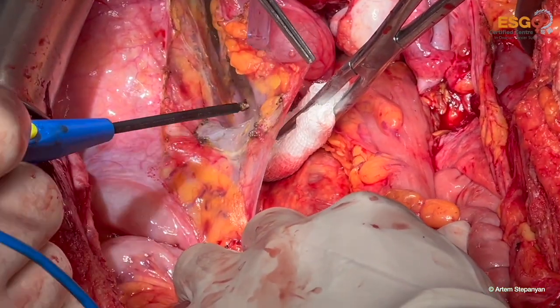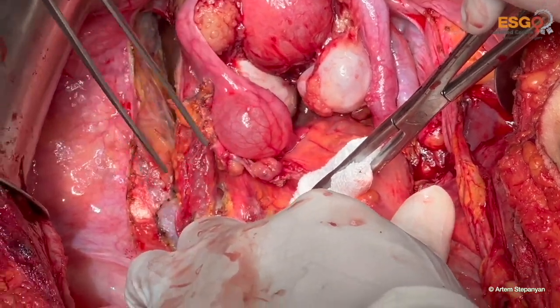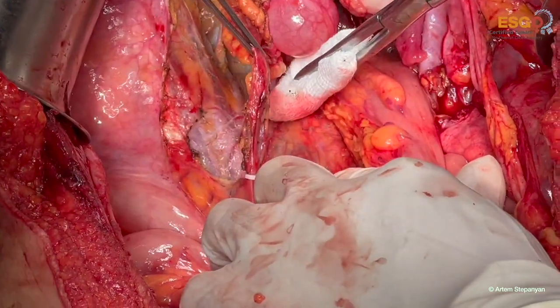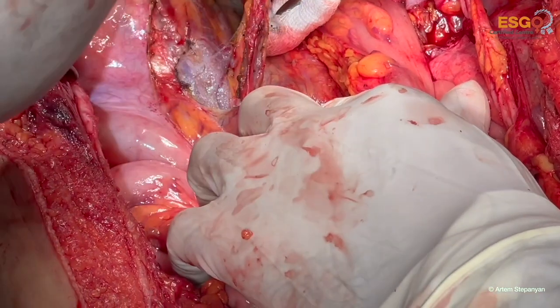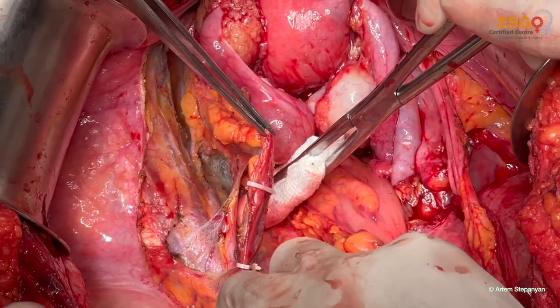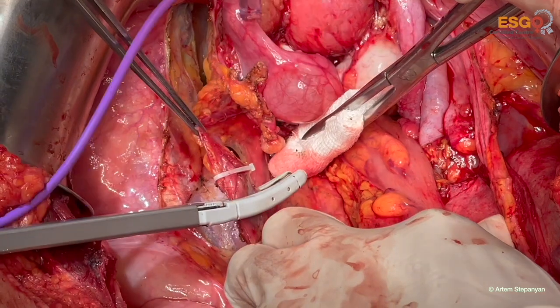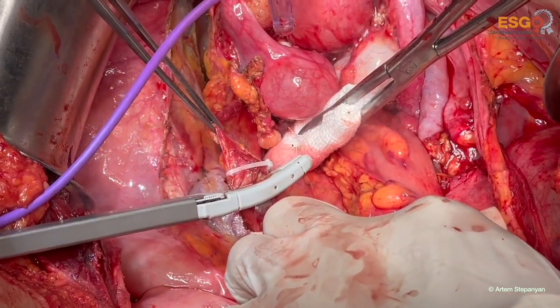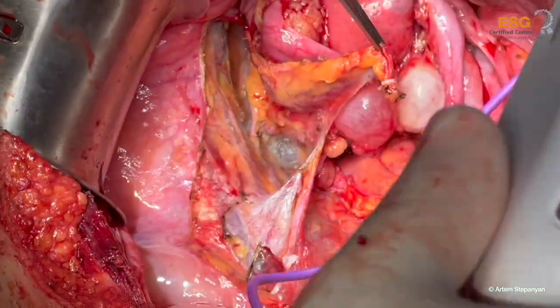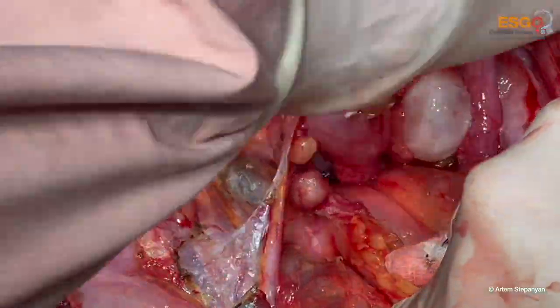Now I dissect the ovarian vessels, I will secure them. Depending on the situation, they can be secured close to the ovaries or close to the aorta and left renal vein. Here we cut the IP ligament just in the pelvic brim. You see the gonadic vessels are clipped and divided. And we see the ureter. And we see the pelvic side wall vascular structures.